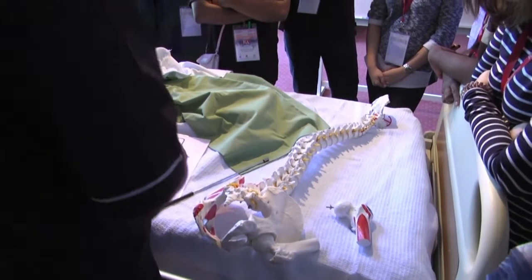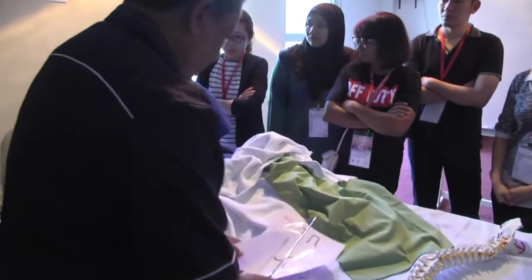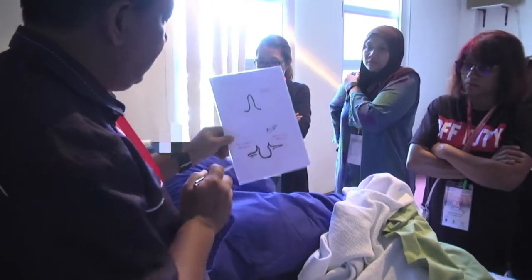You follow what I mean? So this is the basis of what I'm going to show you. Could you lie down again? Now, firstly, while we are preparing, look at this.